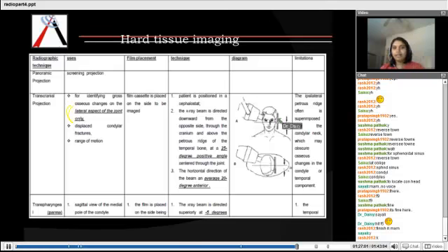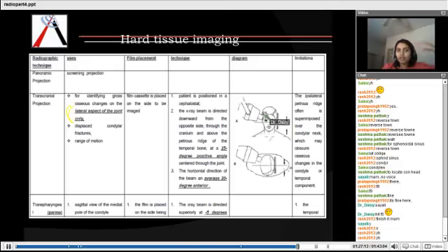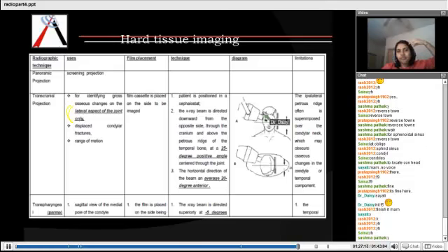Now look at where we are coming from. We have hopefully in your anatomy you remember your petrous ridge inside in your middle cranial fossa. So we keep it here, and our beam is directed downwards and forwards.